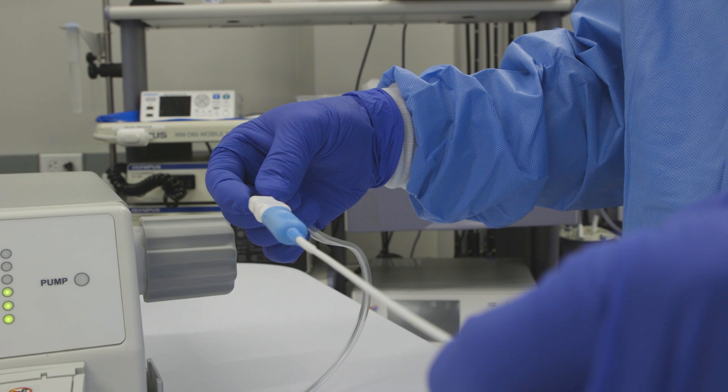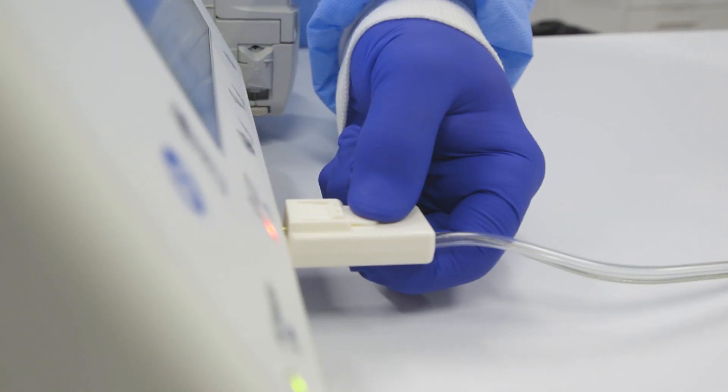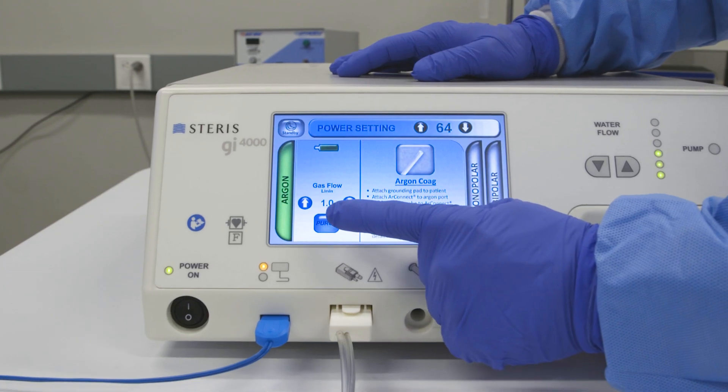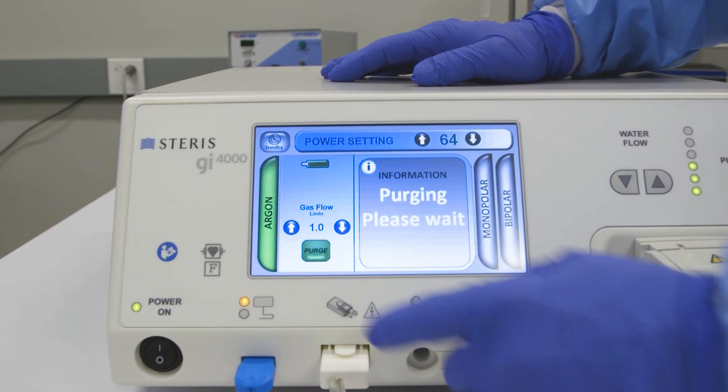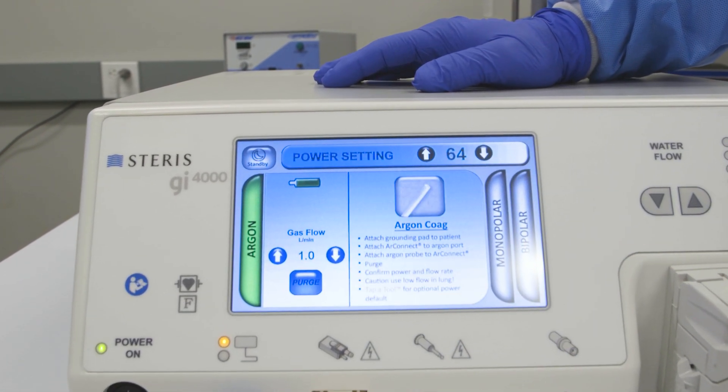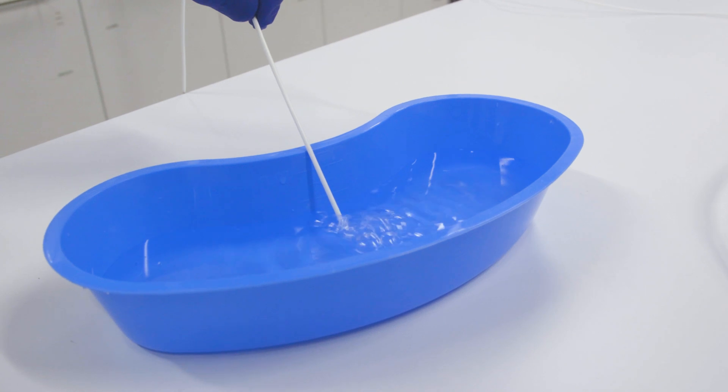If either device has evidence of damage or blockage, replace the accessory. To verify the issue has been resolved, manually purge the argon gas line to ensure gas flows through the accessories properly.